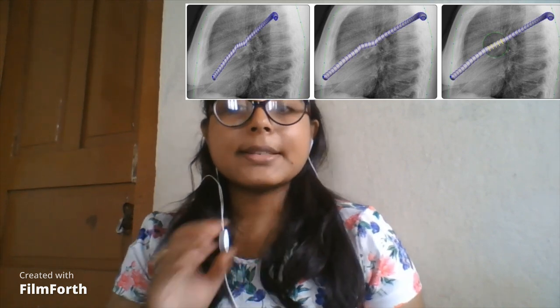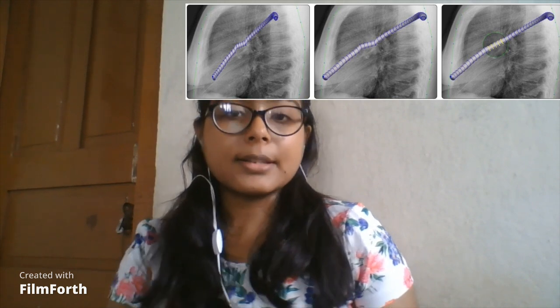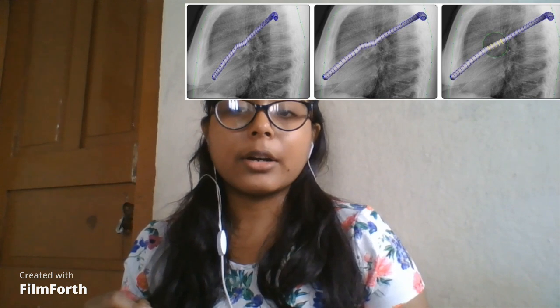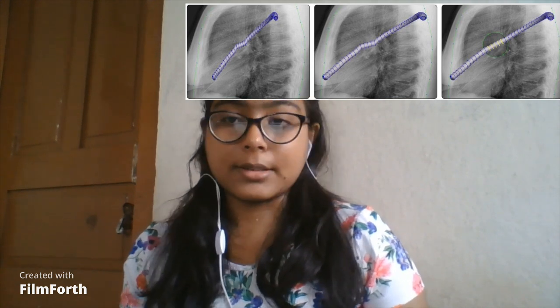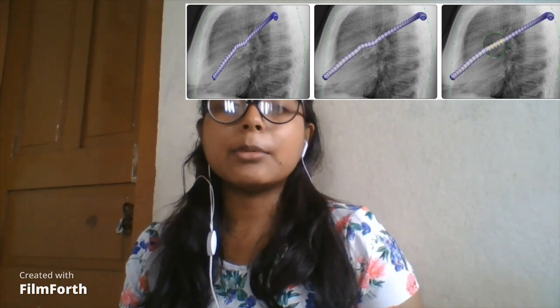The remaining subclusters are assigned to the posterior and the anterior vertex clusters based on whether the y coordinate values are below or above the maximum y coordinate value of the entire lateral vertex cluster. Figure 5 shows the proper diagram of this.